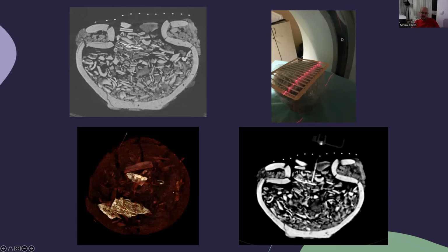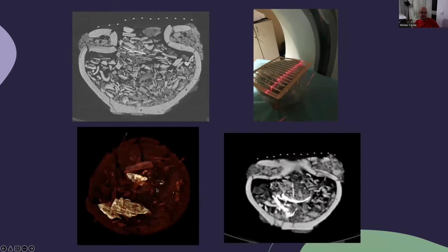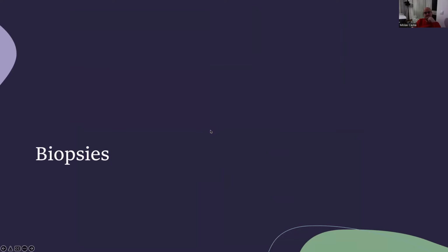We use CT, which is X-ray based technology, for orientation on the horizontal level, and we use this grid for vertical alignment, and then at the crossing of two planes, we insert the needle, which we can then place with the needle tip on the desired position. As you can see here, the needle tip is inserted towards the metal artifact. So we can virtually remove planes and then get the image that we want. We can see here this large metal element.